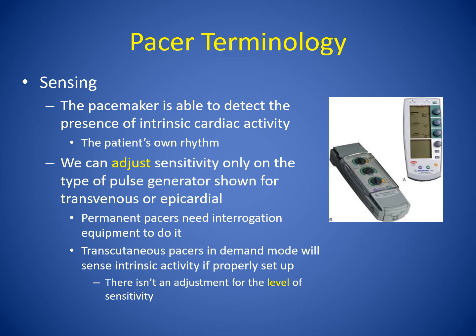And there isn't an adjustment level on the transcutaneous, so you have to be careful because the patient may have artifact. So make sure that you have a proper setup, and that means, depending on the type of pads you're using, you may also have to attach the leads, the 3 leads system, to see the patient's own rhythm and allow the external pacemaker to sense the patient's rhythm.